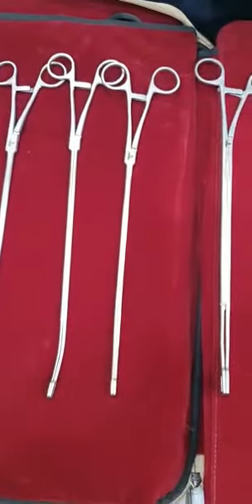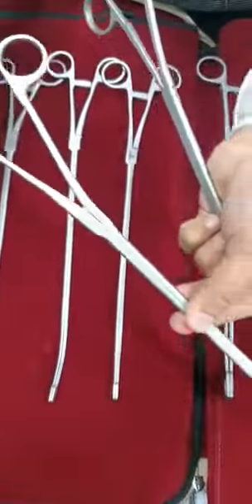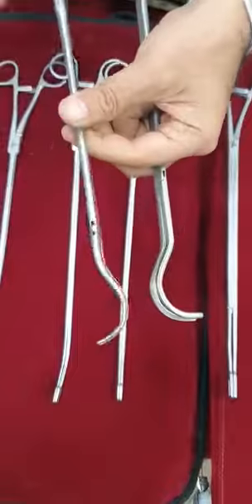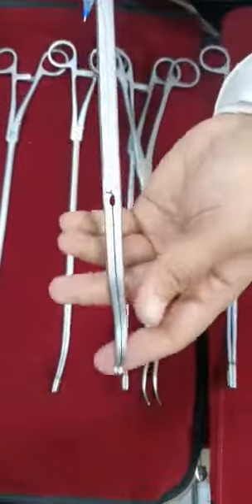We are having Harkun clamps. Different jaw length Harkun clamps are available with us. There is a deep Harkun clamp.